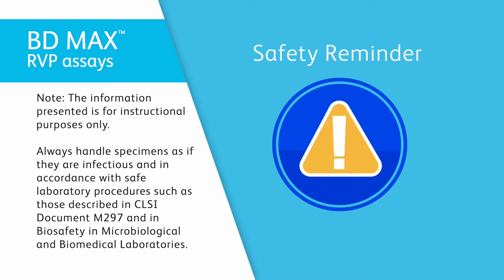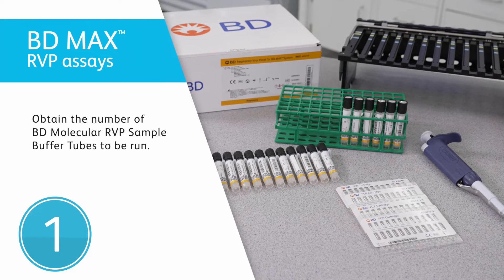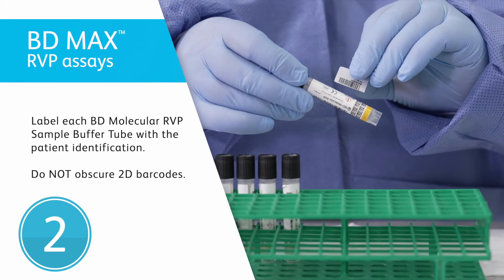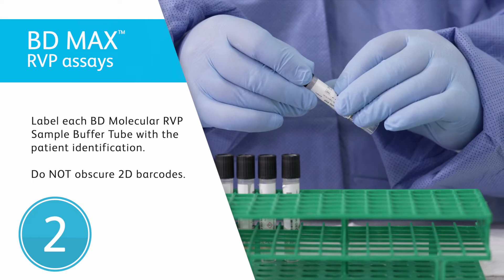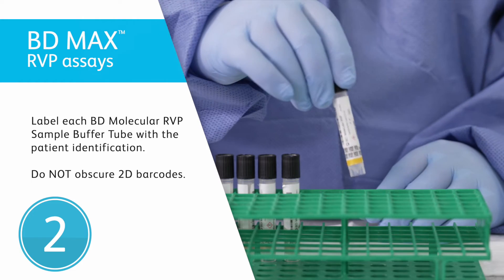Here's how to prepare the specimen. First, obtain the number of BD molecular RVP sample buffer tubes corresponding to the number of specimens. Then, label each BD molecular RVP sample buffer tube with the appropriate patient ID. Be careful not to obscure, write, or label over the barcodes.